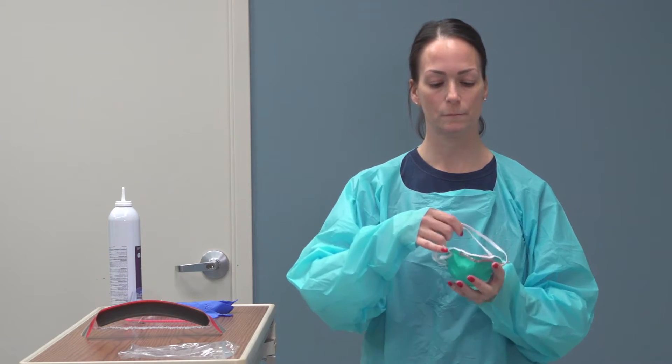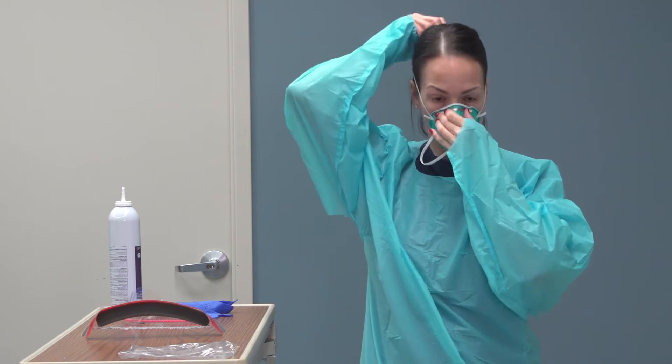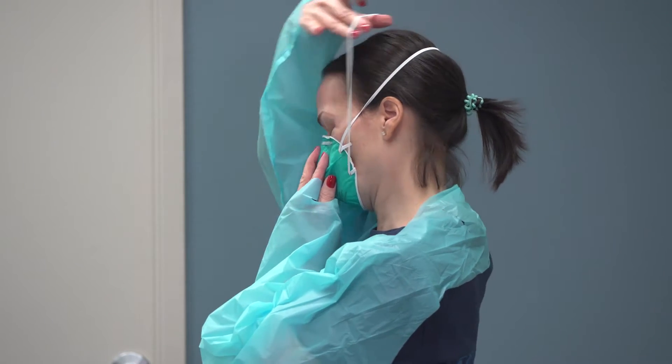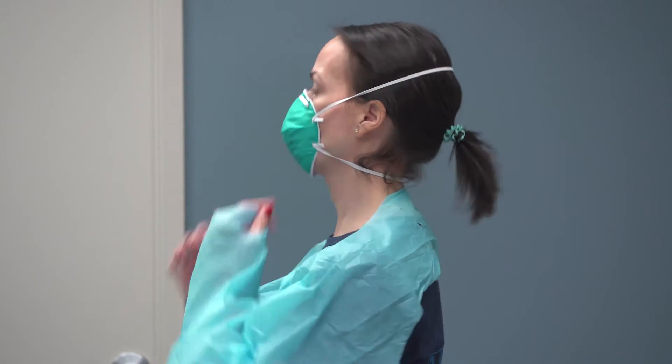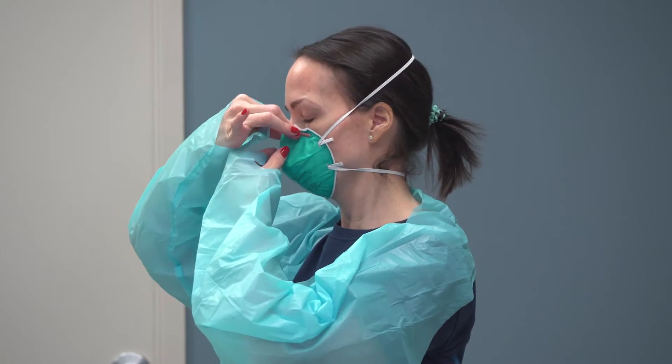Apply N95 mask. Placing the top strap on the crown of your head, the bottom strap should be positioned at the nape of the neck below your ears. Ensure proper fit around bridge of nose. Use nose piece to mold mask to face.